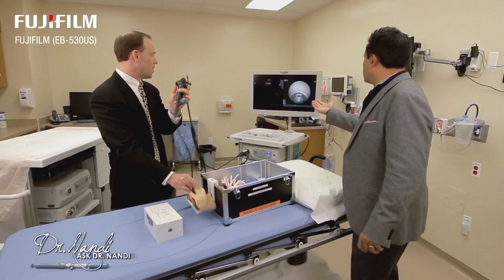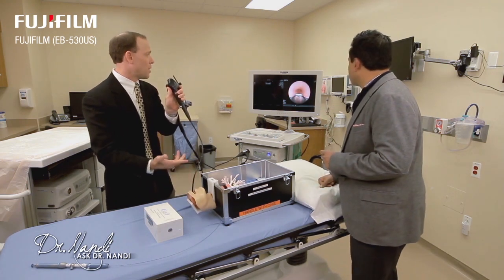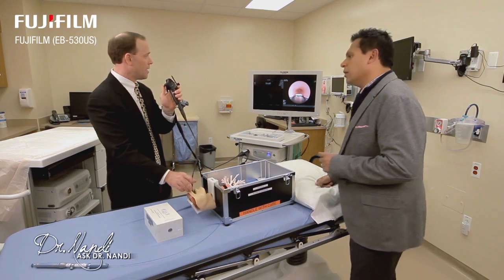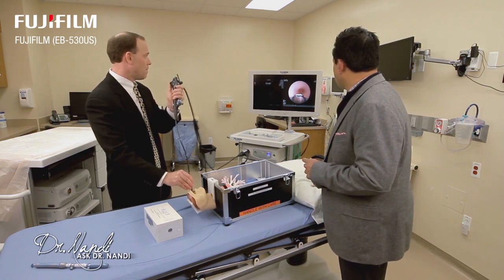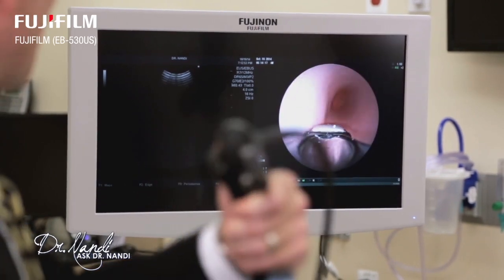So we're talking about the trachea of the patient, right? That's correct. This is what the inside of the trachea would look like. Okay. And the trachea is basically a long tube with cartilage rings in it that connects you into your lungs, right? Connects right to the lungs.